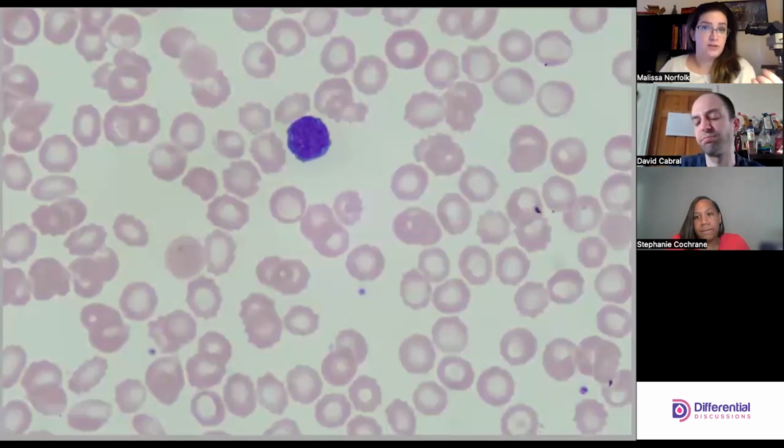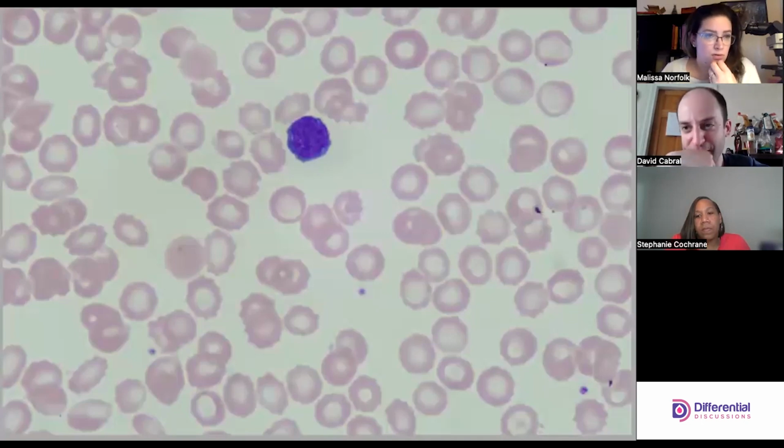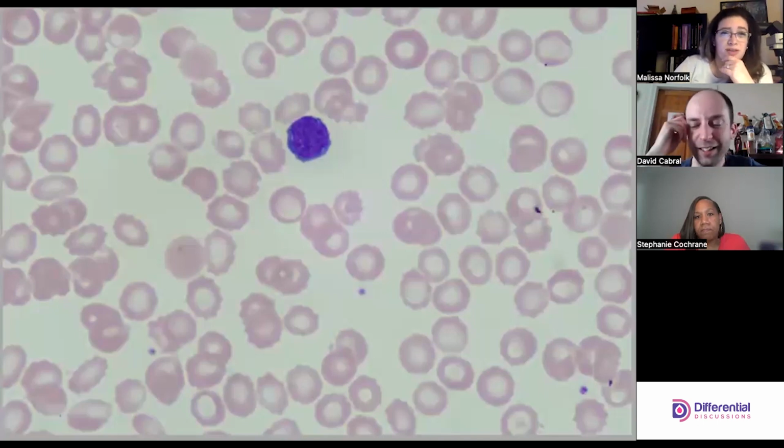The renal failure giving you the uremia, the HUS giving you the thrombocytopenia. I don't know about the white cell count, but it could be something like that. I was thinking it can't be TEC because that's just red cell too. Right, transient erythroblastopenia of childhood, and that'd be parvo. That'd be a virus, which would go with the reactive lymphs that we're seeing. So I guess it could be an aplastic process with a reactive picture, or some kind of infective process.